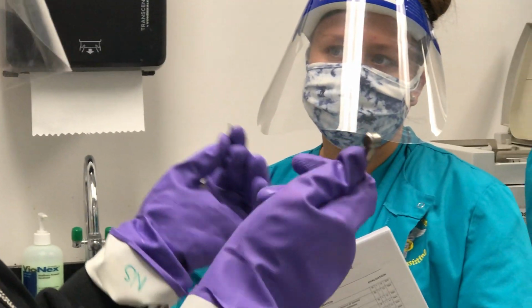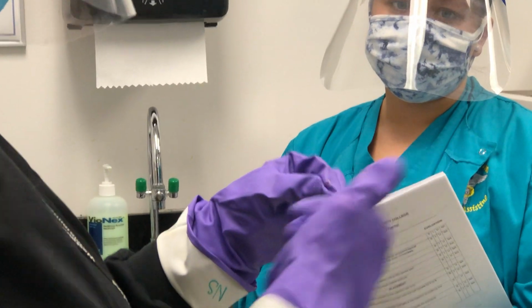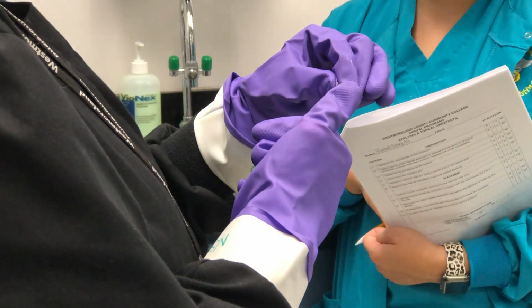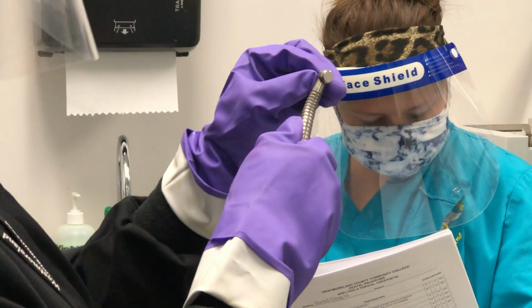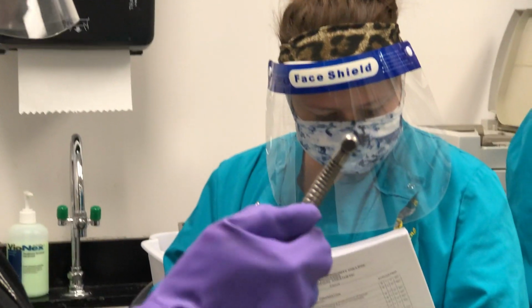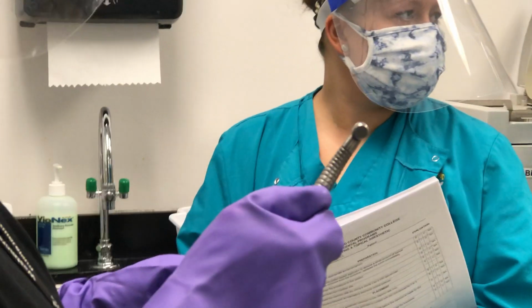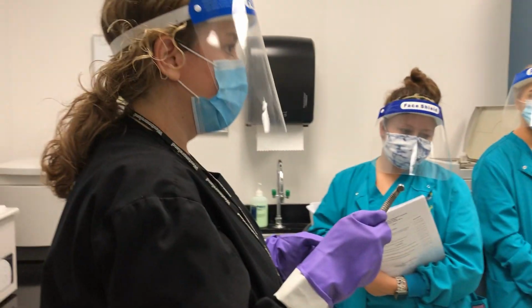We're going to have you show us just how to load the high speed as well. So you push the friction grip button on the back, you load the burr in the chamber, and then you let go and you have to pull on the burr to make sure that it's tight, okay? Why do you have to check it like that? To make sure that it doesn't fall in the patient's mouth. Right. If it's loose, you wanna find out before it's in their mouth.